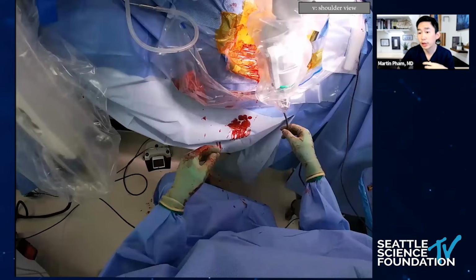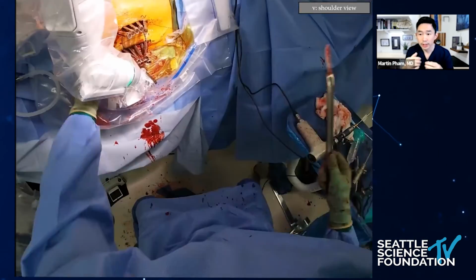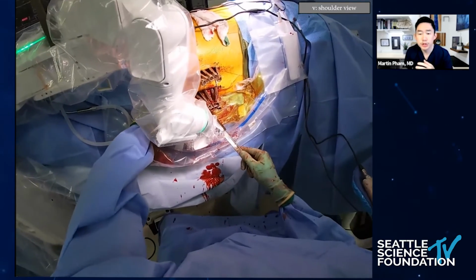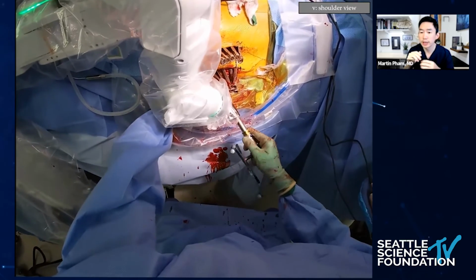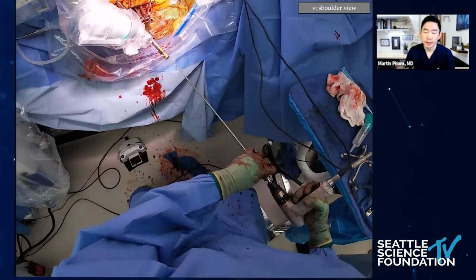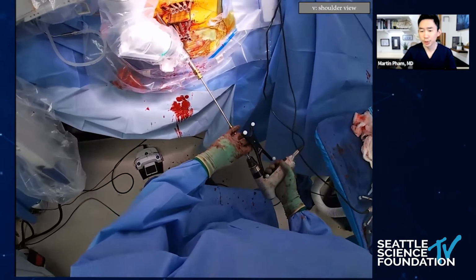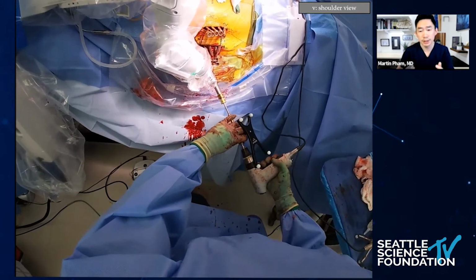And here's a video of what that looks like, right? So the robot comes into position, and then of course you put in all your usual tools. Here's your robot knife, which is a 22 blade. You have your navigated dilator, which is essentially a cannula and tissue protector. You have a long drill. And again, I'm sitting down, and I'm not going to lie, it's a bit awkward, right? Putting the instruments down, going from floor to ceiling.